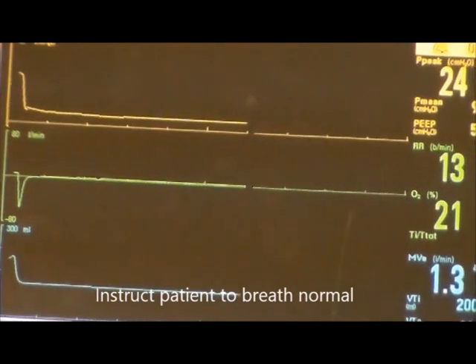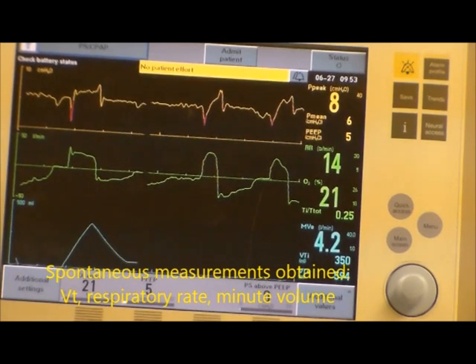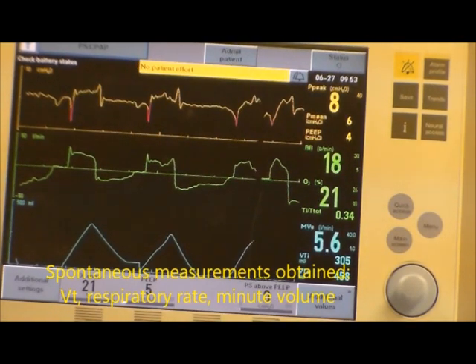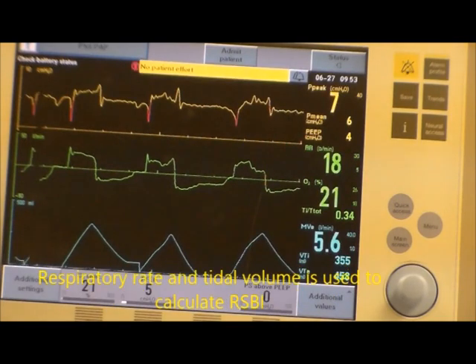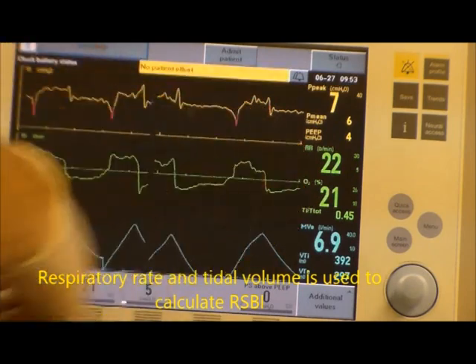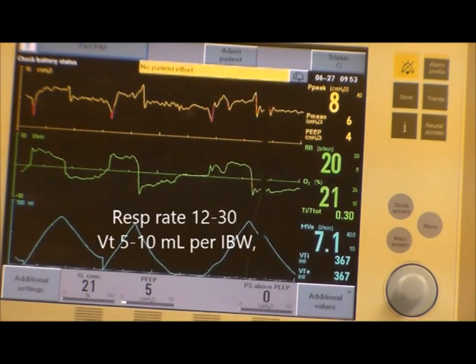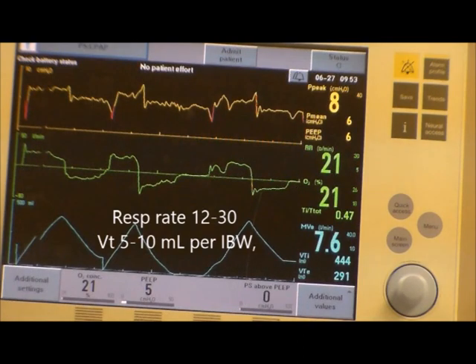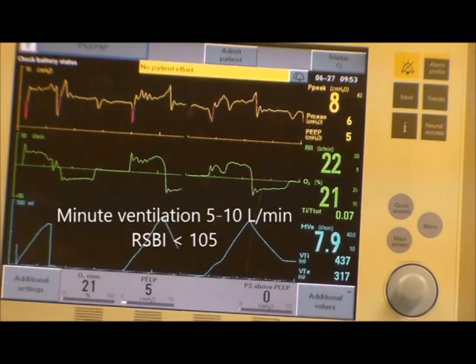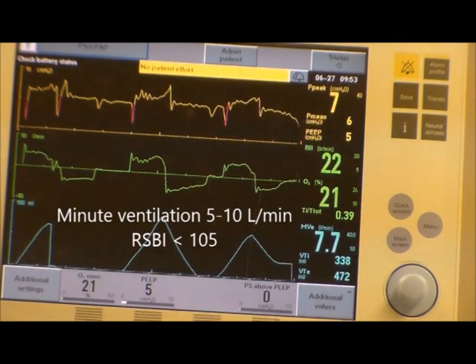Mr. Smith, I want you to breathe nice and normal. From these settings you can get their spontaneous respiratory rate, their tidal volume, their minute volume, and you can calculate their RSBI. Remember: rate you want between 12 and 30; tidal volume goal should be 5 to 10 mls per kilogram based on ideal body weight; minute ventilation 5 to 10 liters per minute; and your RSBI should be less than 105.